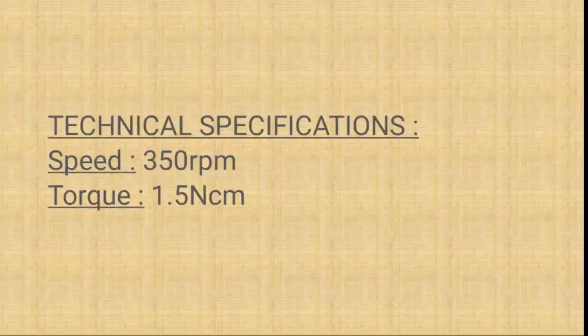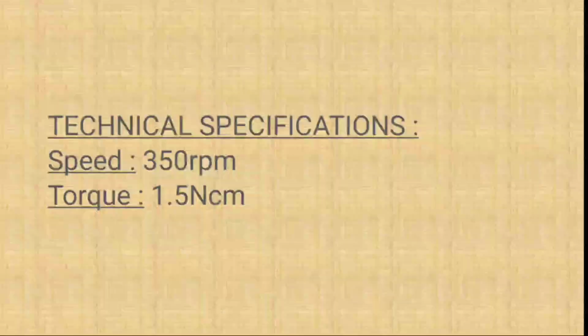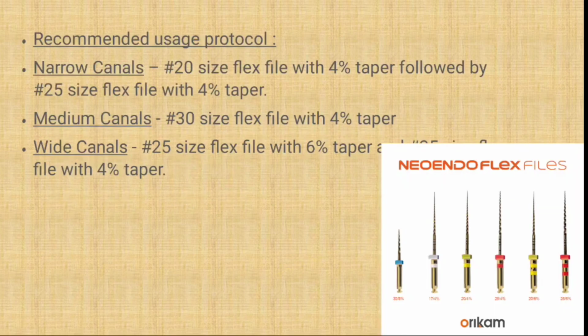So what are the technical specifications? Speed is 350 rotations per minute, and torque is 1.5 Newton centimeter. So what is the recommended usage protocol?